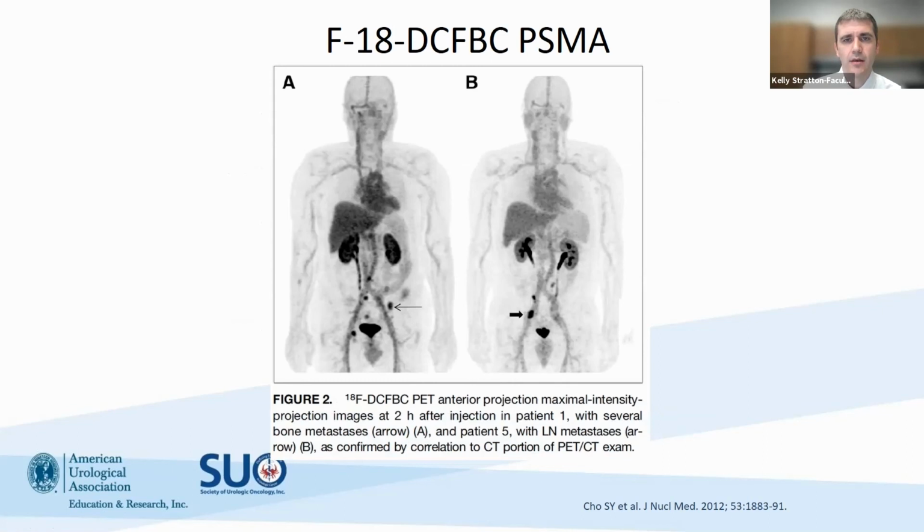And so this is just an additional PSMA study, DCFBC, and you can see where this shows very nicely a metastatic area.